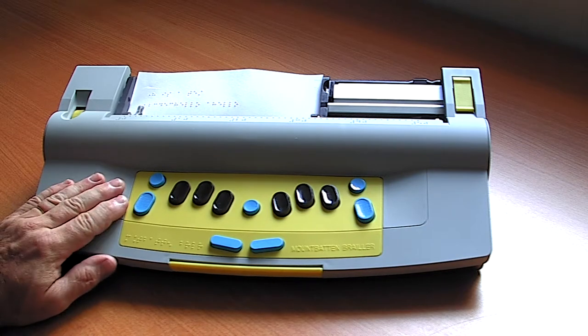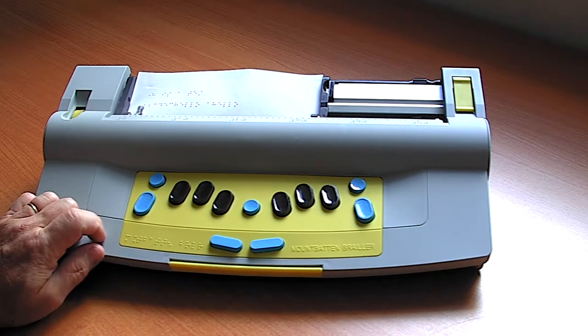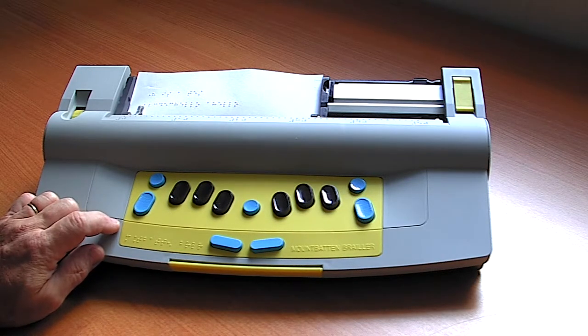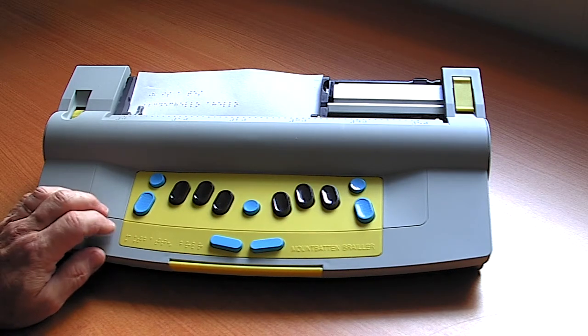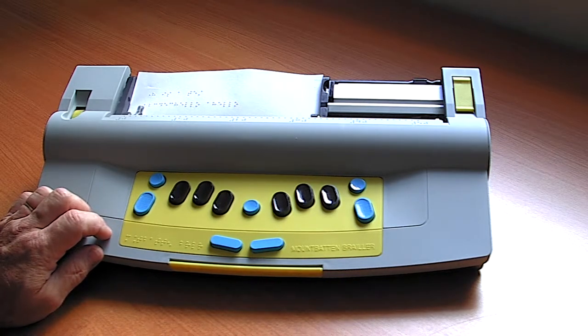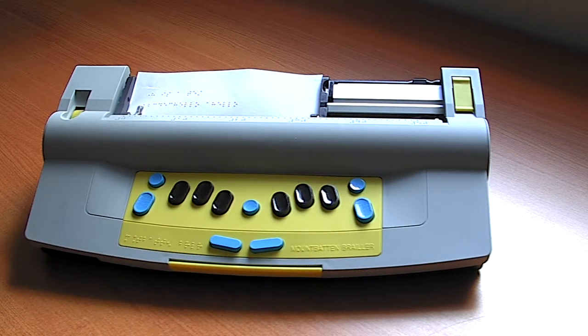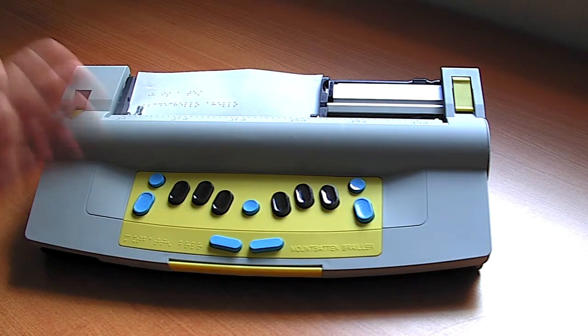That means the Mountbatten will be used successfully in classroom situations without disturbing other children. Another really excellent feature is that it has connectivity to iPads, iPhones, and so on, which means that a sighted person supporting the blind child, even if they don't know Braille, can actually communicate with their iPad back and forth between the device.